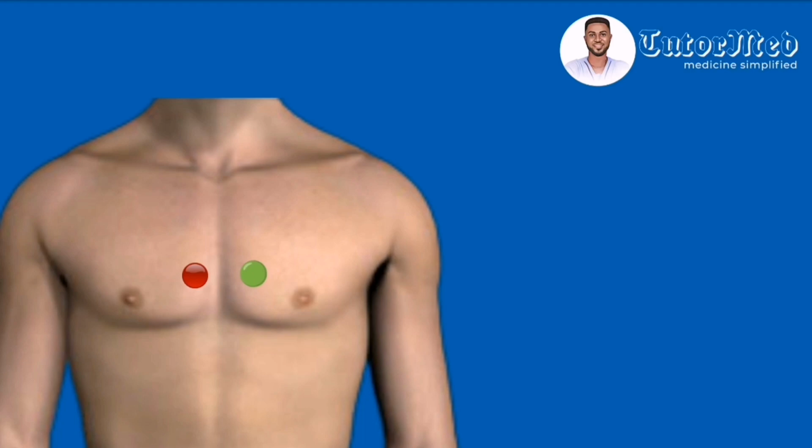Then we skip the 3rd and we move to the 4th electrode. And so for the 4th, we put it in the 5th intercostal space mid-clavicular line on the left. And this location also happens to be the location of a normally placed apex. After we've placed the 4th electrode, we put the 3rd electrode in between the 2nd and the 4th electrodes.